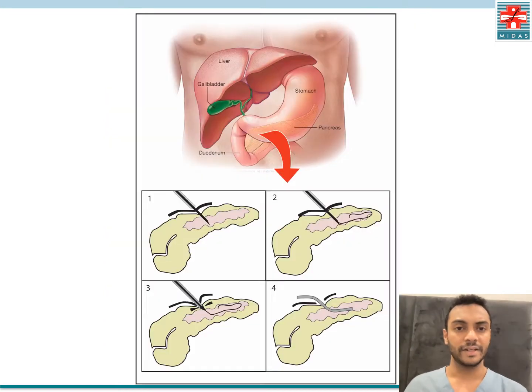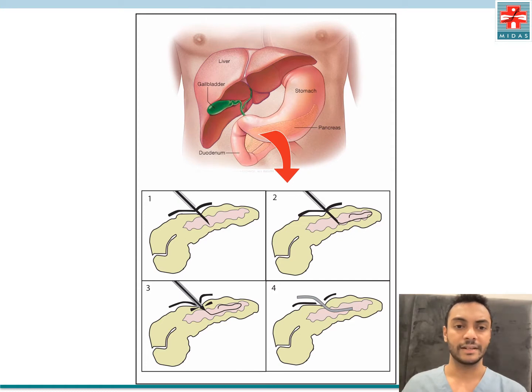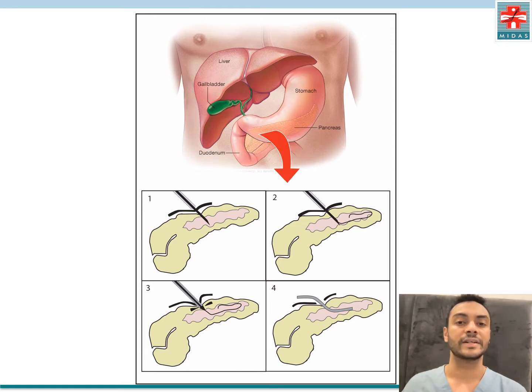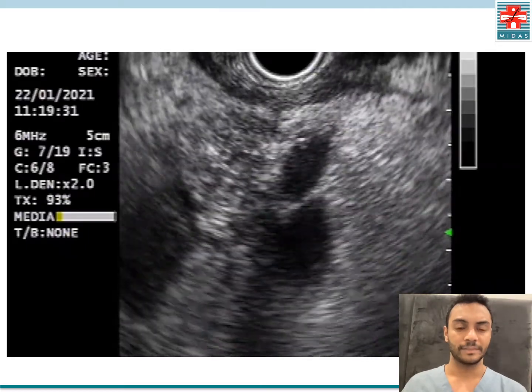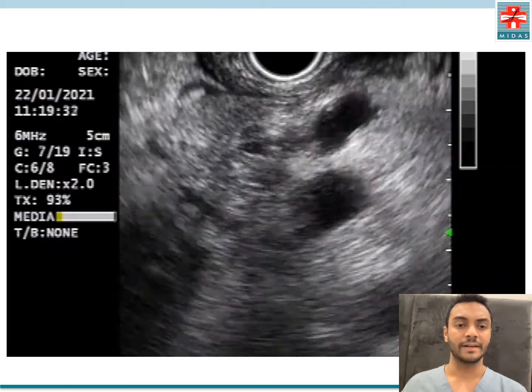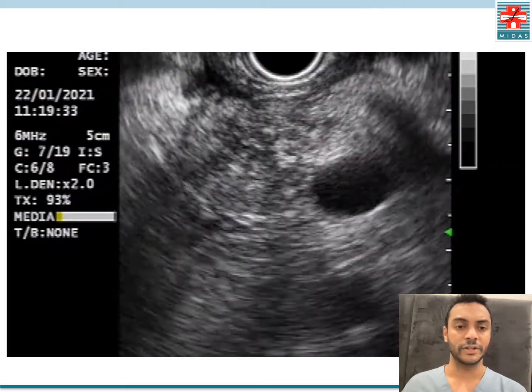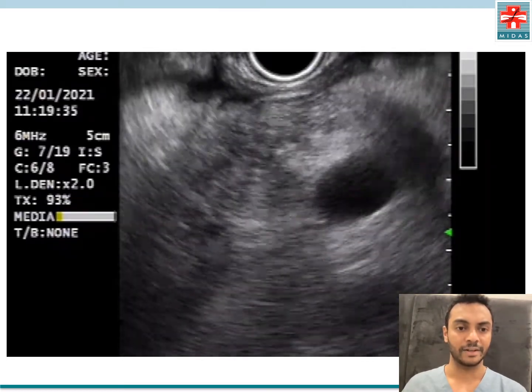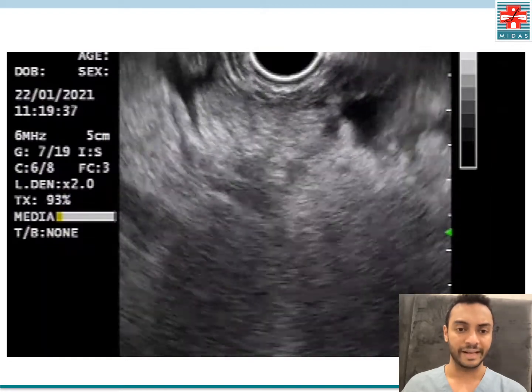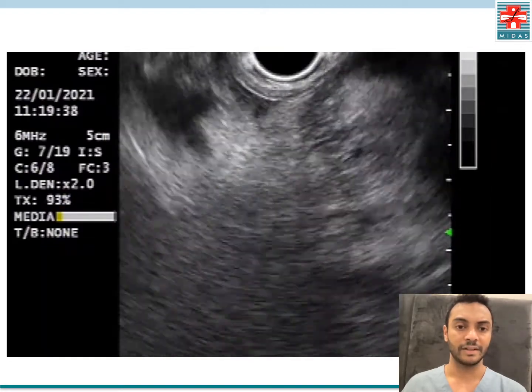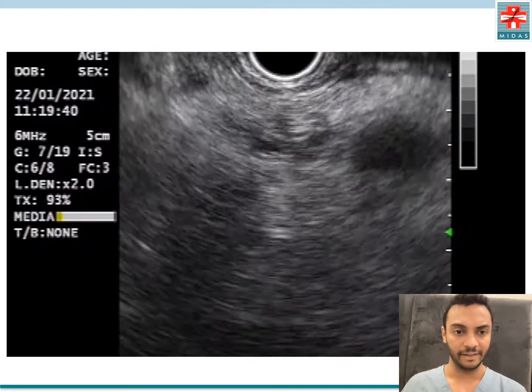We decided to offer the patient EUS-guided pancreatic gastrostomy, as illustrated in this figure. Under EUS examination, the pancreas parenchyma was carefully examined from the neck region around to the body and tail.